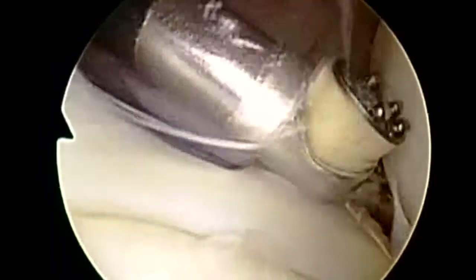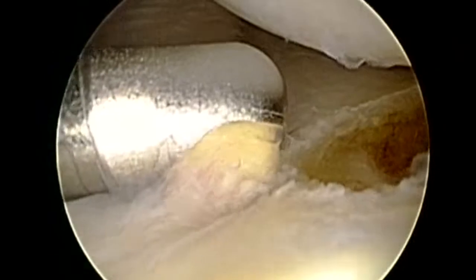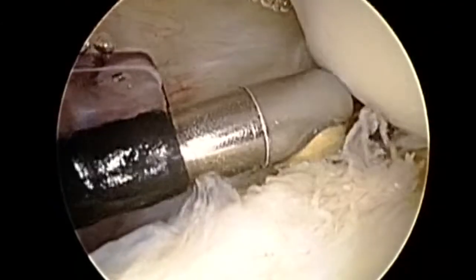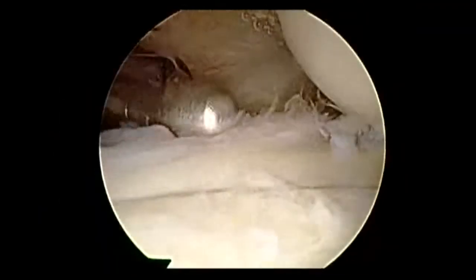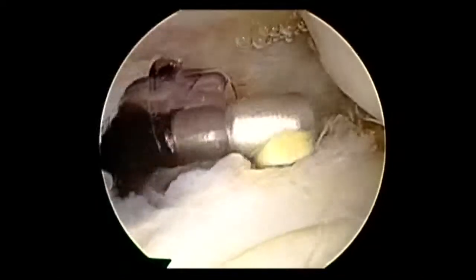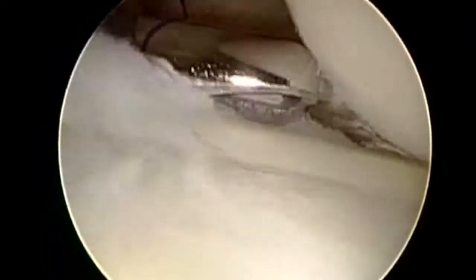So it's not enough just to perform a capsulotomy. You actually want to excise the scarred capsule to prevent any reformation. Now we're viewing actually from the anterior superior cannula and using an Arthrocare wand to complete our posterior capsular release.